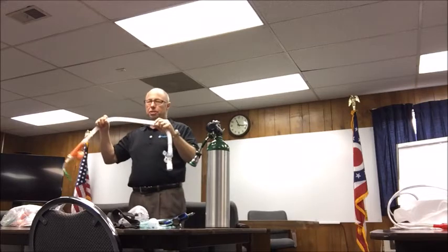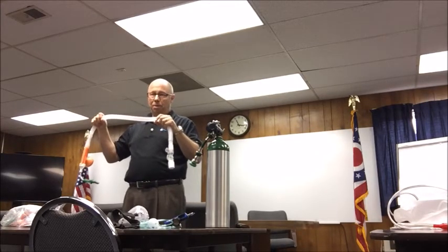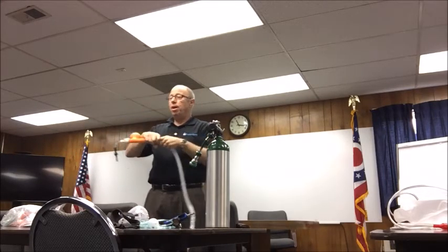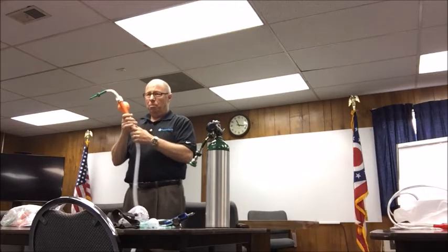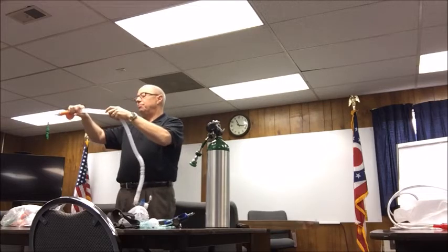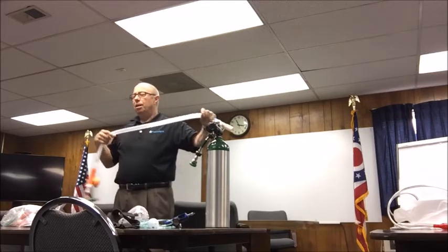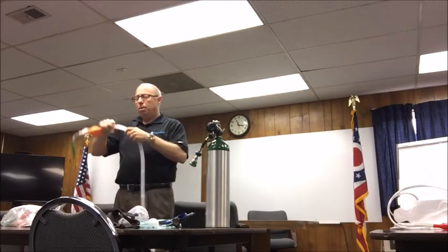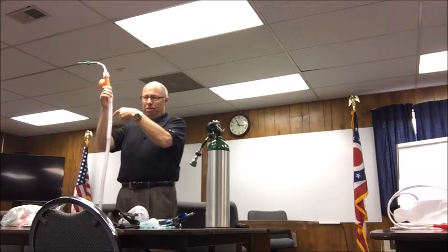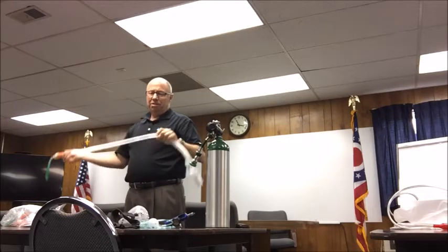This will stretch to 6 feet or 72 inches. It does not have to be opened all the way for it to work. It doesn't have to be opened at all. One of the things that we hear every once in a while is that it makes a whistle. Every once in a while you get a patient where it makes a whistle. So if you keep this collapsed about 3, 4, 5 inches here and pull from this side, it will stop that whistling. The reason it's whistling is the air is coming at 140 liters per minute. It's just turbulating through that corrugation, and that's what creates the whistle. It does not affect the efficacy of this system.